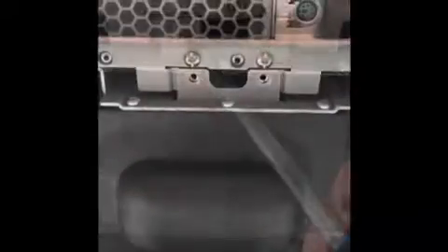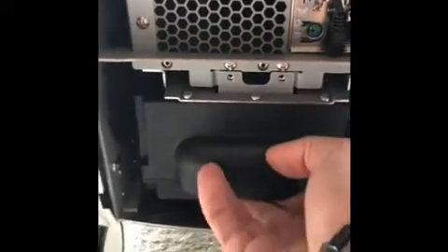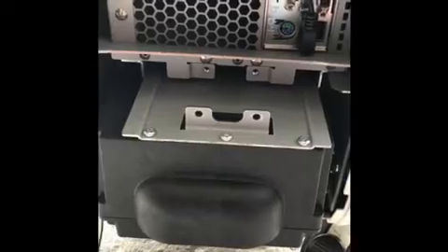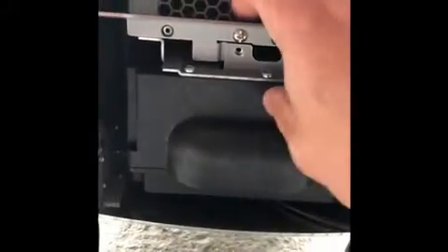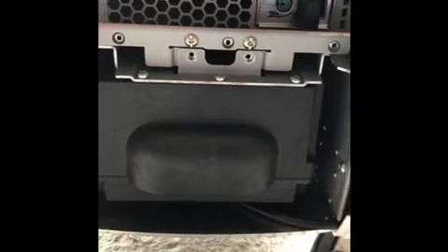Once you have the screws removed, you can just grab the battery and give it a little yank and it'll slide out. You don't have to take it all the way out — just slide it back in. Then put the two screws back in and the unit should turn back on.